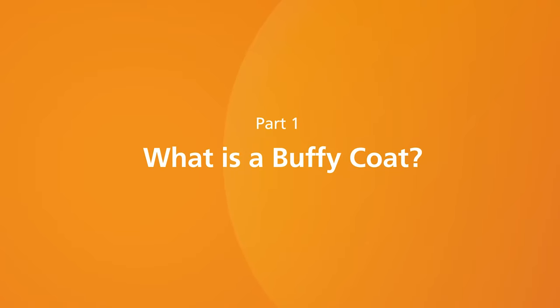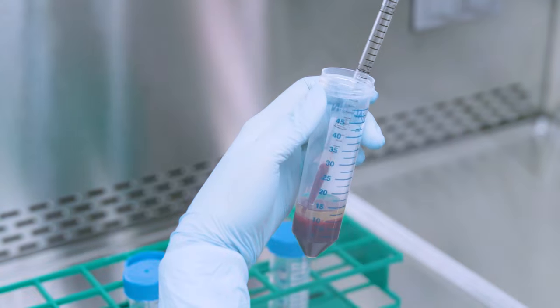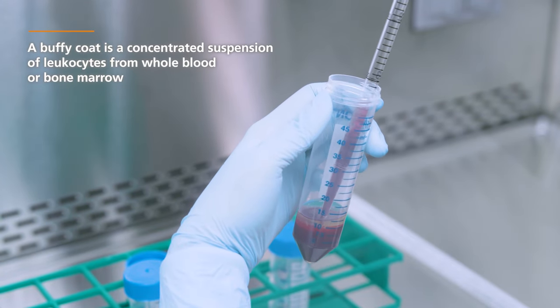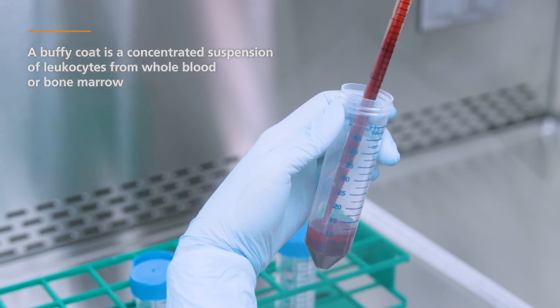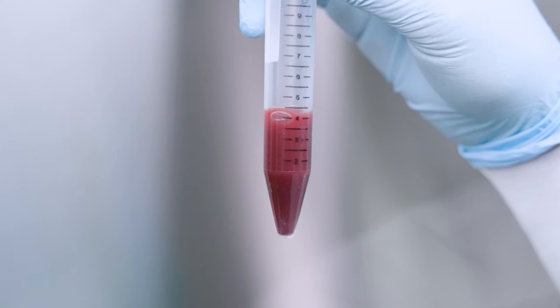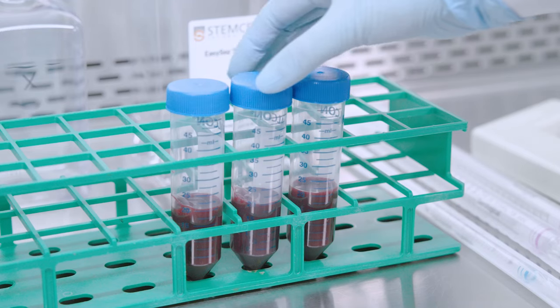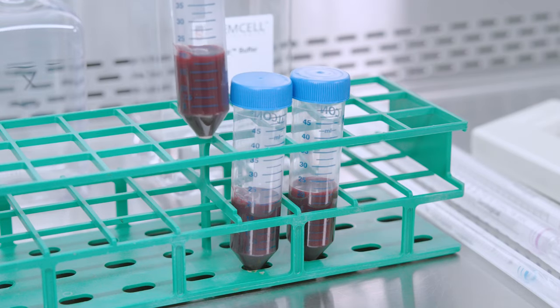Part 1. What is a Buffy Coat? A Buffy Coat is a concentrated suspension of leukocytes from whole blood or bone marrow. Generating a Buffy Coat from whole blood samples helps to concentrate large sample volumes and reduce downstream cell separation handling.